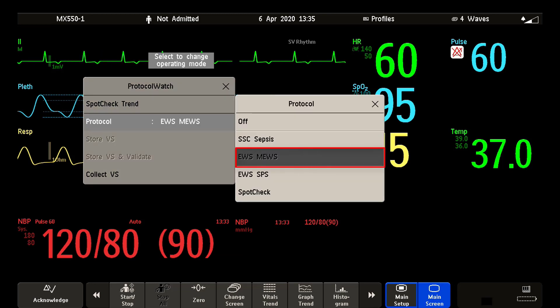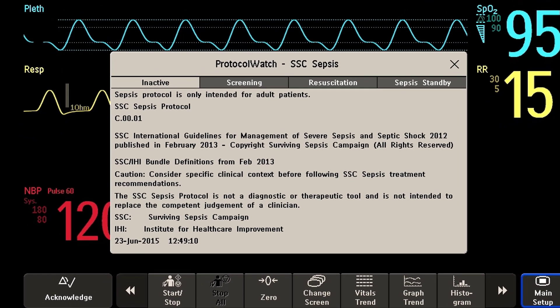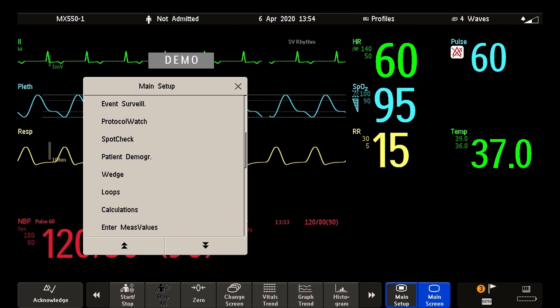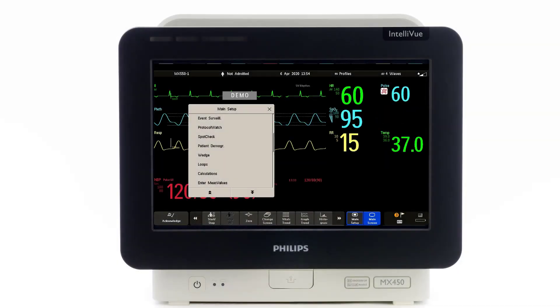Your Intelliview patient monitor may also be equipped with the SSC sepsis protocol in the Protocol Watch application. This application is a screening and guiding treatment tool following the guidelines from the Surviving Sepsis Campaign to monitor your patient for septic shock. You can also enable event surveillance monitoring to trigger a notification and record significant episodes in your patient's condition. Note that the early warning score, the SSC sepsis protocol and event surveillance are pre-installed features which require optimization to your hospital's policy before you can start using them.